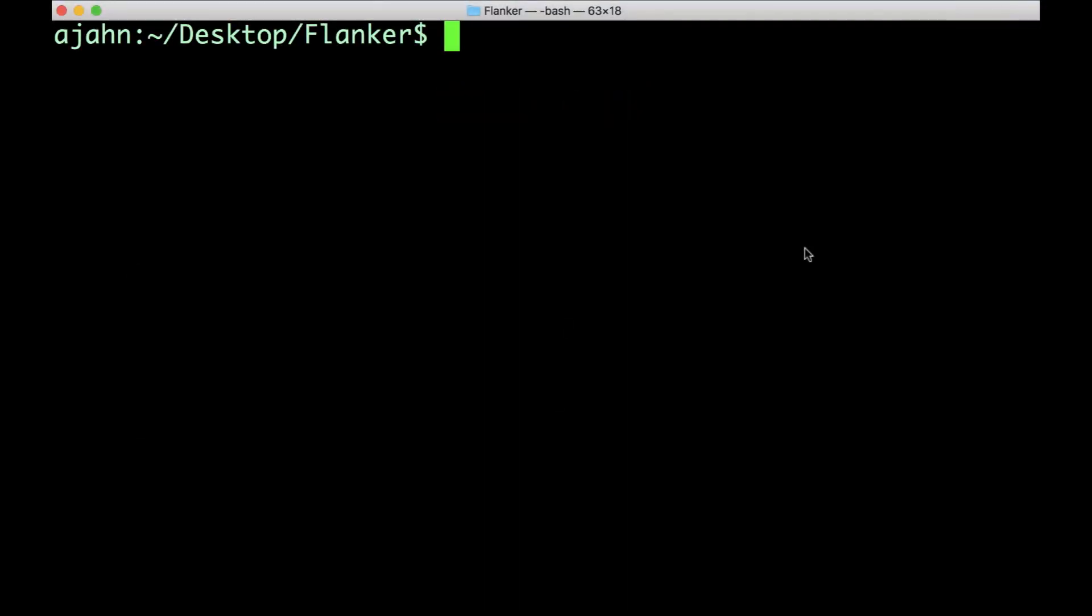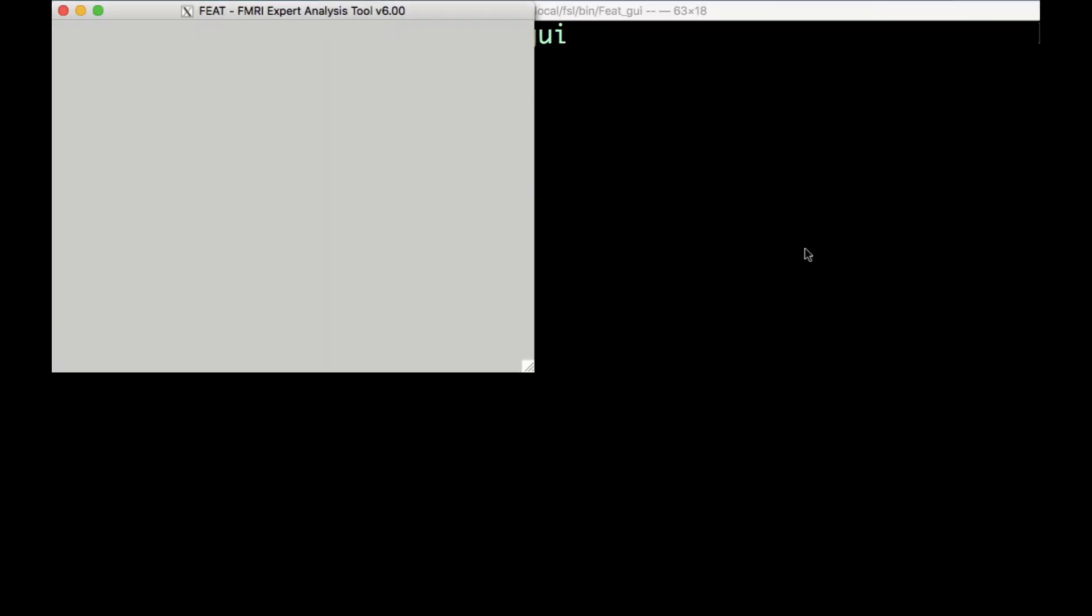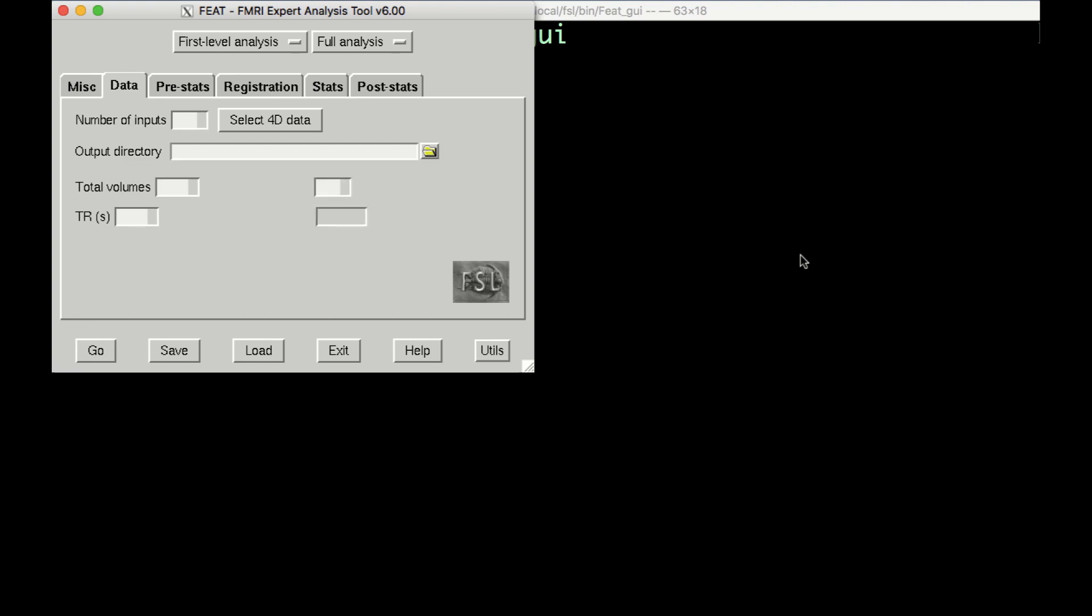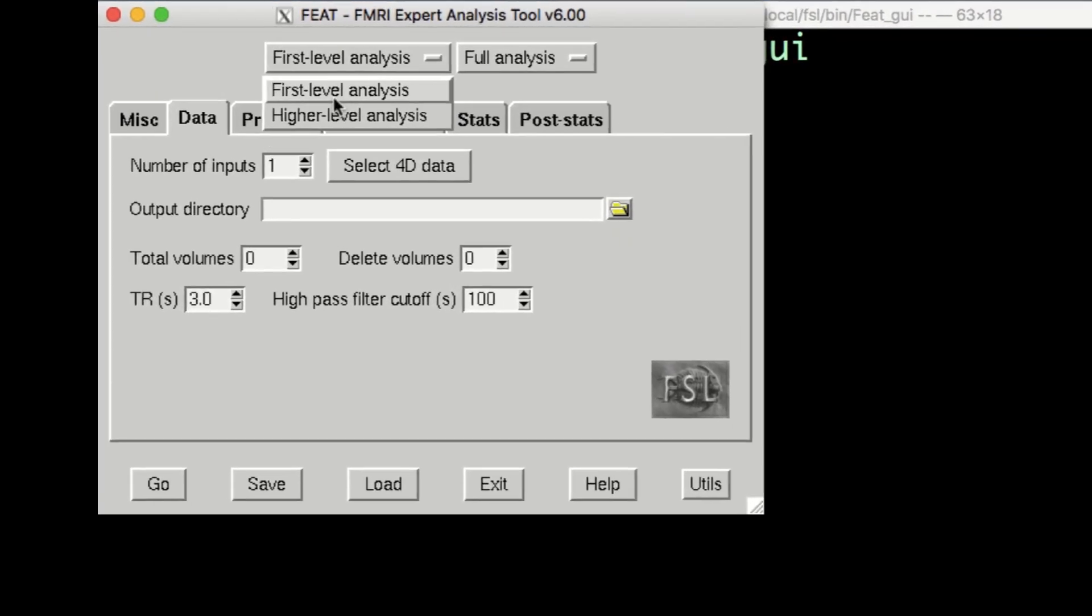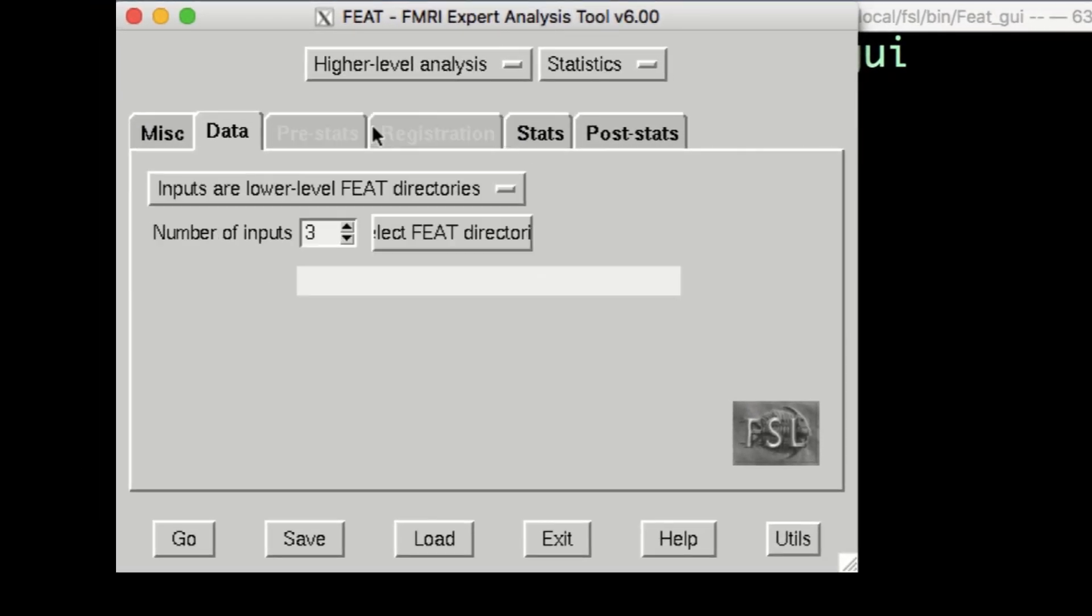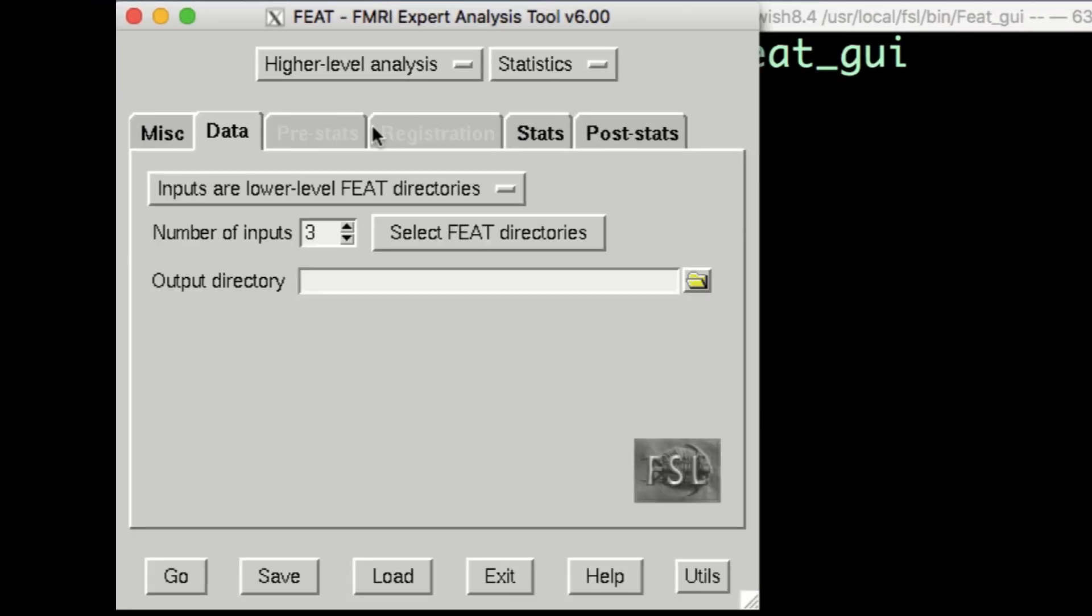From the Flanker directory, open the Feat GUI from the command line by typing Feat_gui. Then from the drop-down menu, select Higher Level Analysis. This changes the input field to Select Feat Directories.